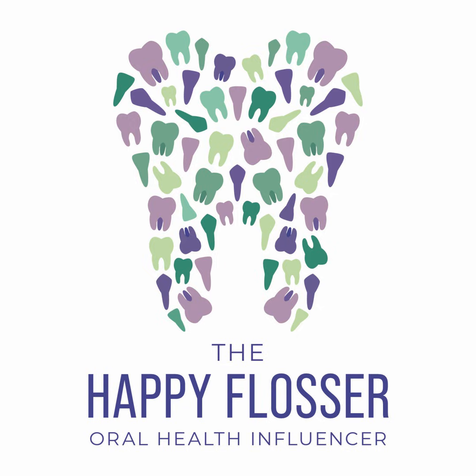Now, thinking about the periodontal ligament space, and that's the space located between the tooth root and the lamina dura. And remember that periodontal ligament is attached at the cementum and the alveolar bone by way of Sharpey's fibers. So the periodontal ligament attaches the tooth root to the socket wall, and that appears radiolucent on a radiograph. Now, the appearance of what that periodontal ligament fiber looks like can be different if there is disease present, and that should be noted when you are doing your radiographic interpretation.